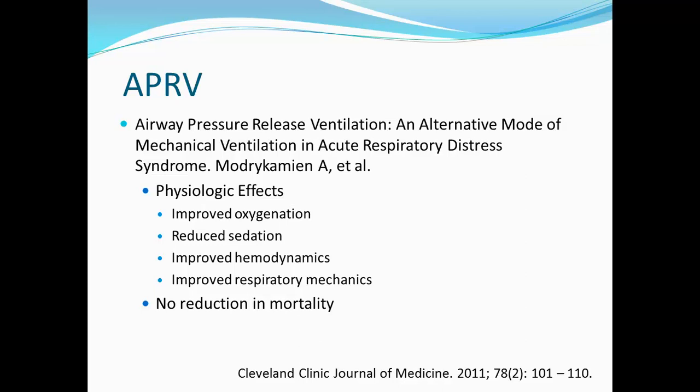Patients generally have improved hemodynamics, probably due to the improved venous return with the spontaneous breathing at P high, and there's improved respiratory mechanics generally and increase in compliance from alveolar recruitment. However, there was no reduction in mortality.